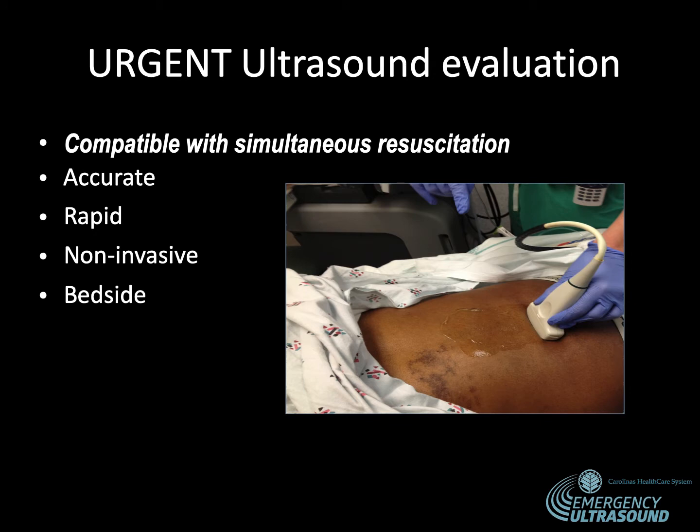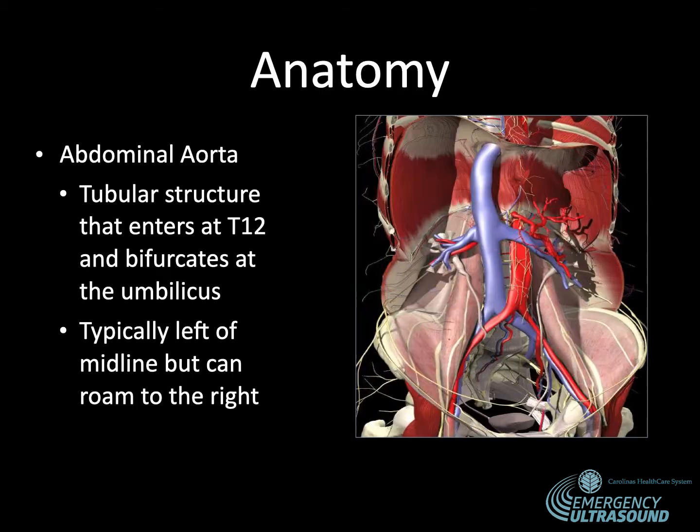So we perform the aorta ultrasound as an emergent or urgent ultrasound evaluation as we are resuscitating a patient with a potential AAA or ruptured AAA. It's accurate, it's rapid, it's non-invasive, and it can be performed at the bedside, making it a great imaging modality.